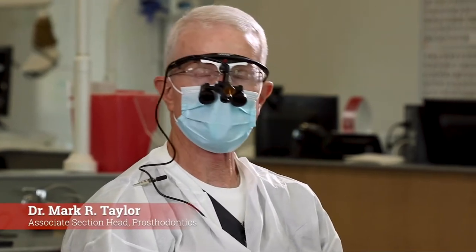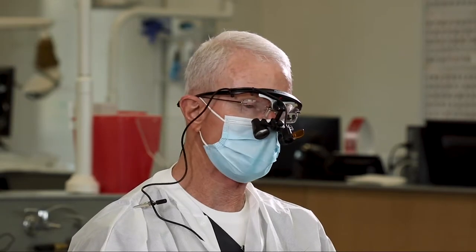Today we're going to be preparing tooth number 14 for a full zirconia crown. This will be very similar to the preparation that we did on tooth number 30, only rather than a rounded shoulder margin we're going to change to a chamfered margin. Both are acceptable with zirconia and you can do it either way.